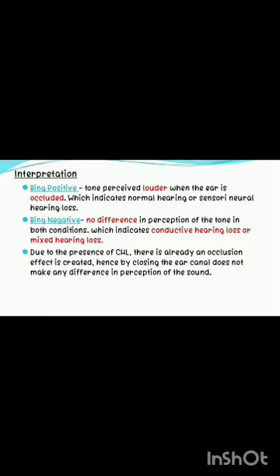Bing negative, no difference in perception of the tone in both conditions, which indicates conductive hearing loss or mixed hearing loss. Due to the presence of conductive hearing loss, an occlusion effect is already created. Hence, closing the ear canal does not make any difference in perception of the sound.